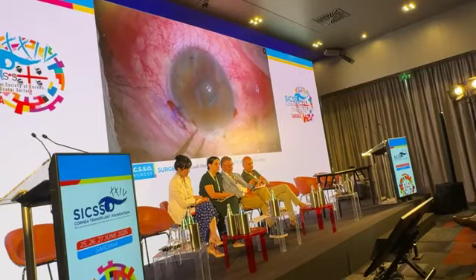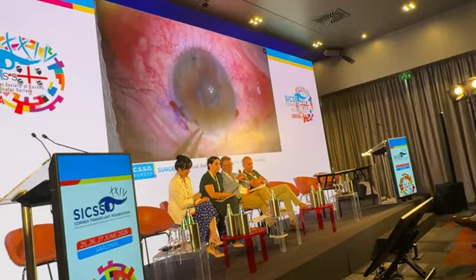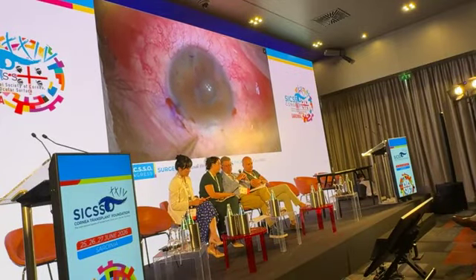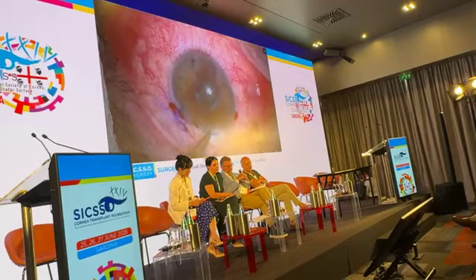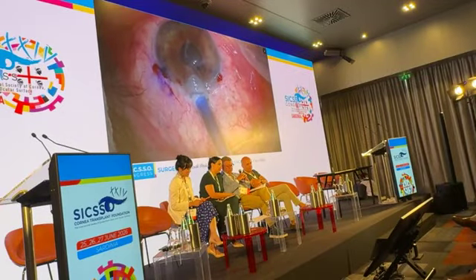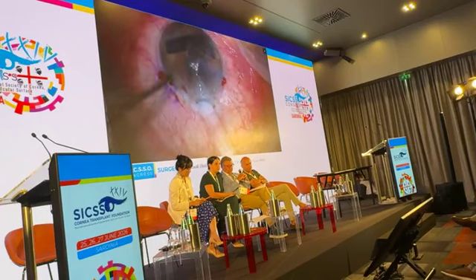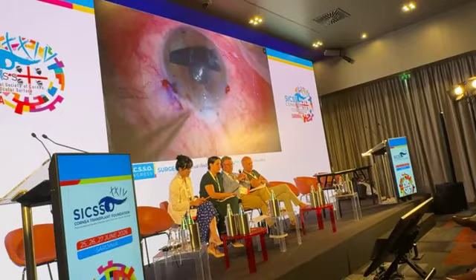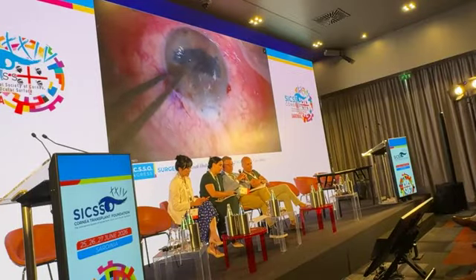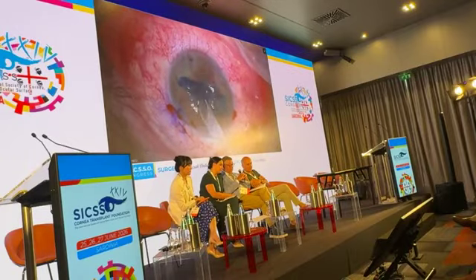So we are now at the toughest moment of the surgery, which is the injection of the graft and the unfolding of the graft in the anterior chamber. As you can see, he is entering the anterior chamber with the injector. What's the diameter of the wound and the injector? So the wound is 3 millimeters. 3 millimeter. And the injector?